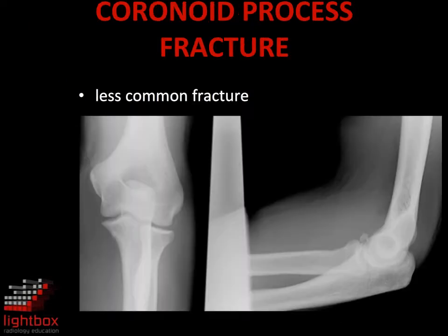Fractures of the coronoid process are less frequent in adults, but are commonly overlooked due to superimposition of the fracture fragment with overlying bones. They are usually associated with a haemarthrosis.